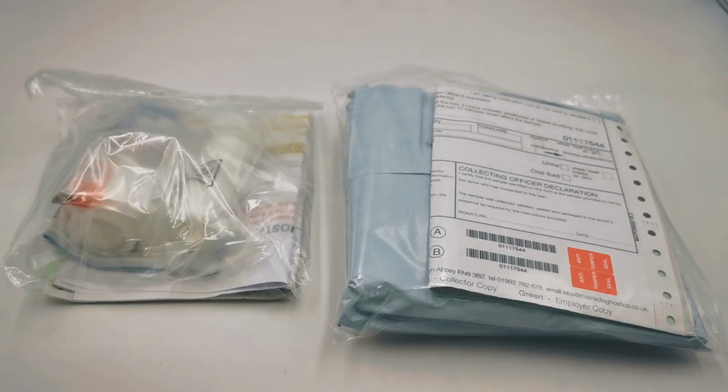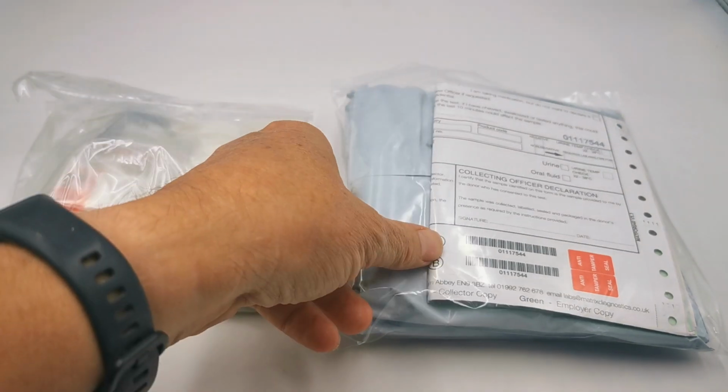Well, welcome to this UK drug testing and ValueMed demonstration video and guidance for filling in and completing successfully the paperwork form that is supplied to you as part of a laboratory confirmation drug test. We've got the two packs that you're likely to be receiving online if you order these: saliva and urine.